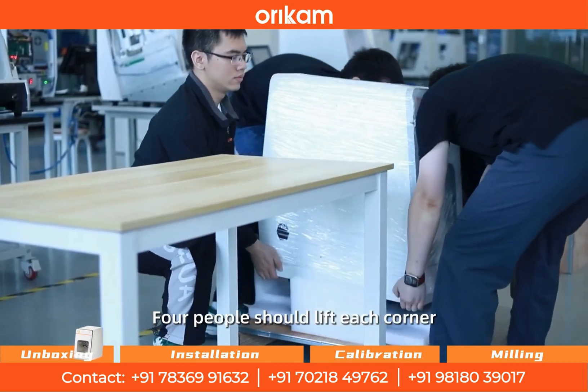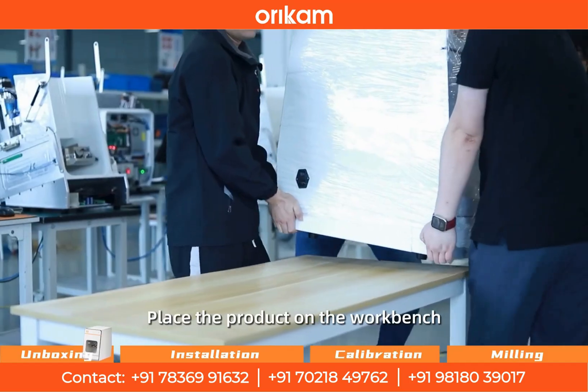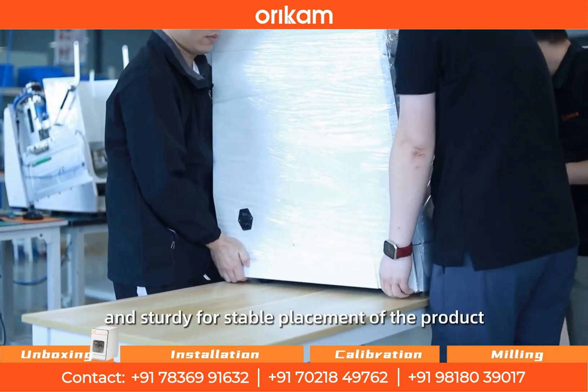Four people should lift each corner of the machine carefully to avoid dropping. Place the product on the workbench, ensuring the workbench is stable and sturdy for stable placement of the product.